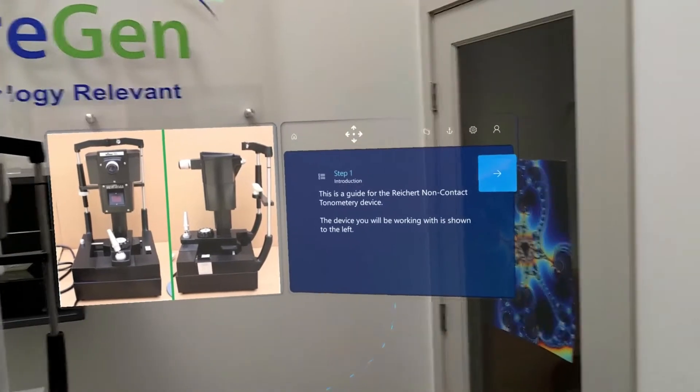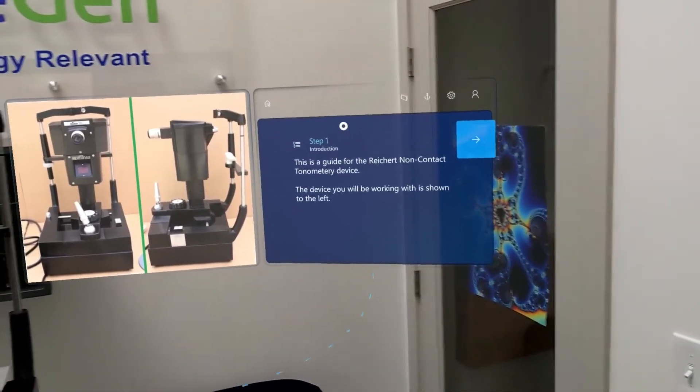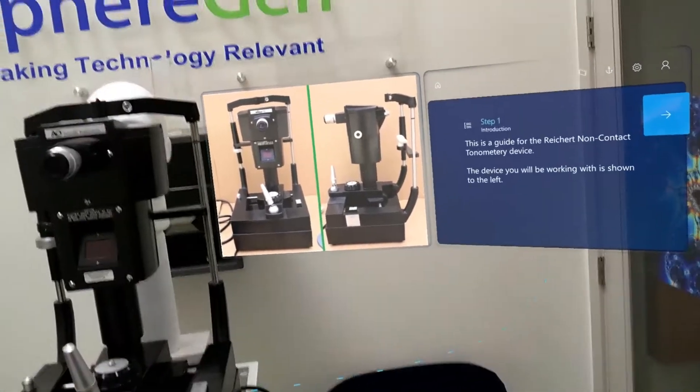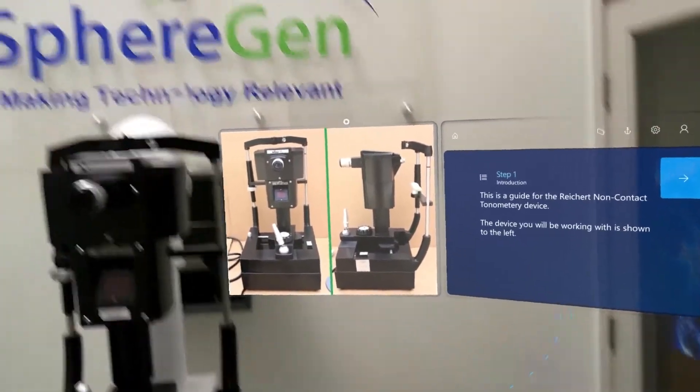Step one. This is a guide for the Recurt non-contact tonometry device. The device you will be working on is shown to the left — some visual confirmation in this image that we are working on the correct piece of equipment. This can be a video as well.